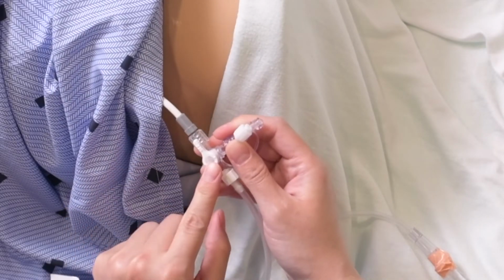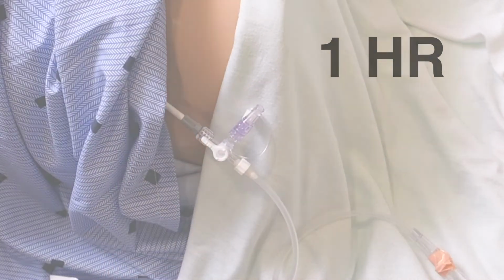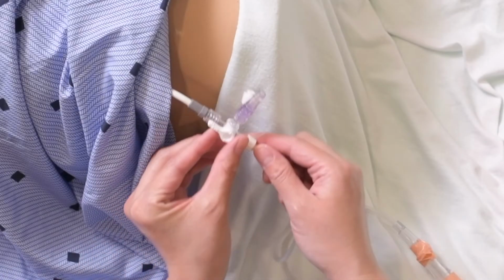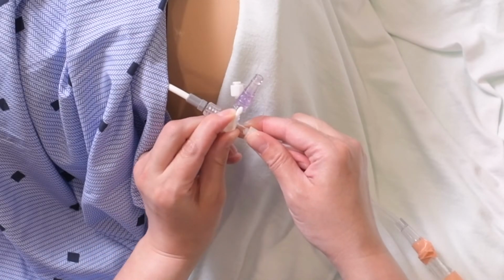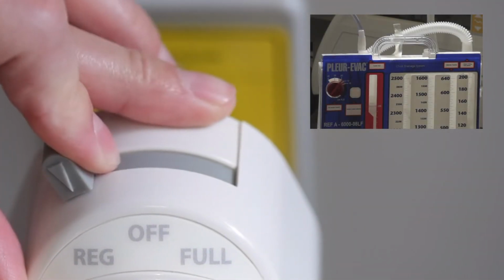Close the catheter for 1 hour. Turn the valve so that the off is towards the patient. After 1 hour, return the valve so that the off is in the neutral position, and open the drainage system. Place the drainage system under wall suction as prescribed.